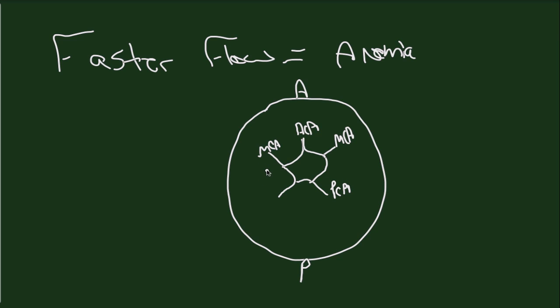The measurement of the middle cerebral artery is performed here with color Doppler or power Doppler. The image is obtained, or the proximal middle cerebral artery is enlarged to occupy more than 50% of the image and is sampled about 2mm after its origin from the internal carotid artery.